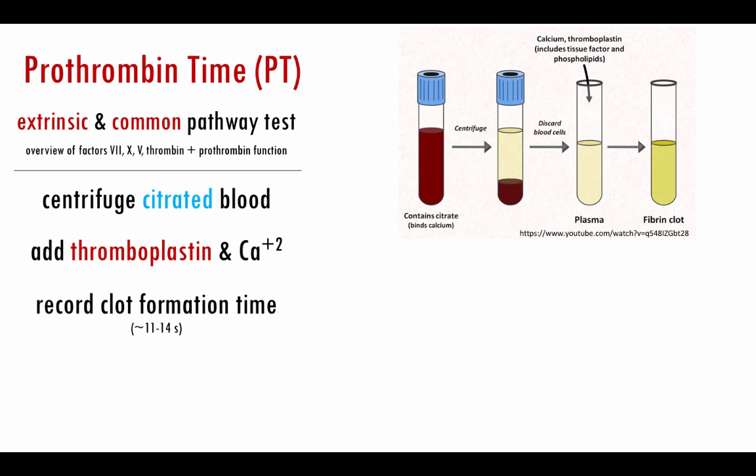That's normal. If it's elevated, it takes longer. That could be an issue. If it's depressed, that can also be an issue. So we need to measure how long it's going to take from step 1 to clot formation, and it should be less than 15 seconds. So how you can tell that the clot has happened is by measuring the viscosity or the turbidity change.